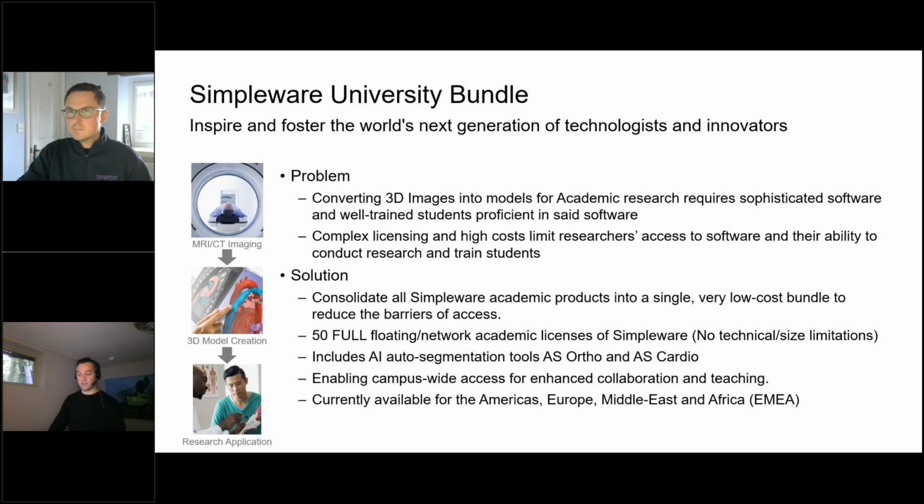And this is currently available for the Americas, Europe, Middle East, and Africa. We are looking at APAC and trying to expand it there, but that's to be determined currently. And the one limitation, which should be rectified soon, is 2 of the modules, the CAD, for those of you familiar with Simpleware, the CAD and NURBS module are not included in the university bundle. That will be included soon, so keep an eye out for that as well. But we already have a lot of academics who are very happy about this, and we've deployed a lot of licenses to get them going. So we're pretty excited about this. So with that, I'll pass it off to Ross, and he can demo the software.